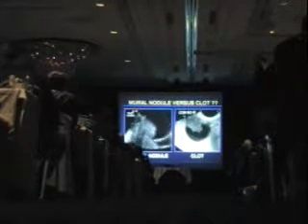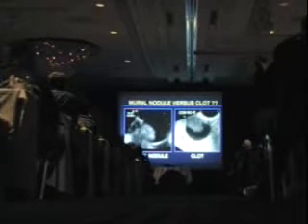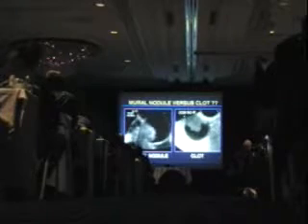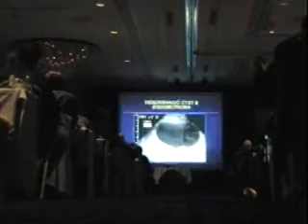Don't send her to surgery. Don't get worried, because if you follow it, it should go away. If it looks like this and you put color on, I can almost guarantee you there'll be flow in that, in which case you'd be worried right away. And there were other findings in that woman.